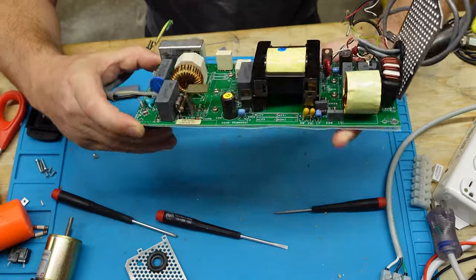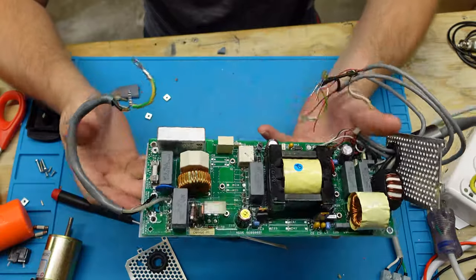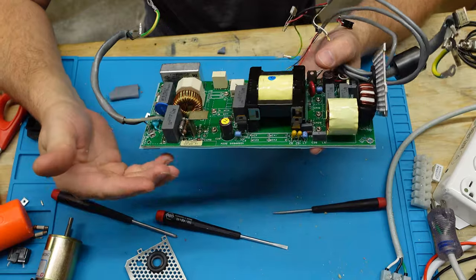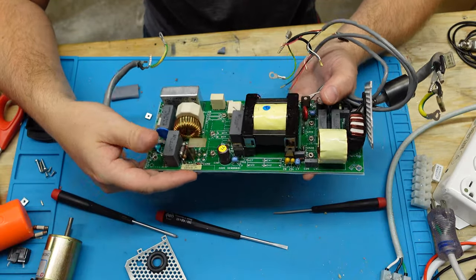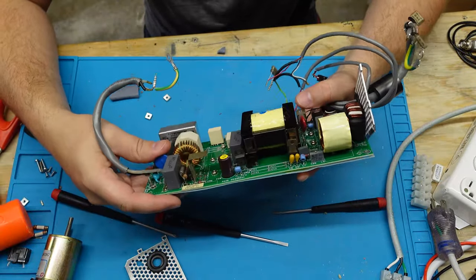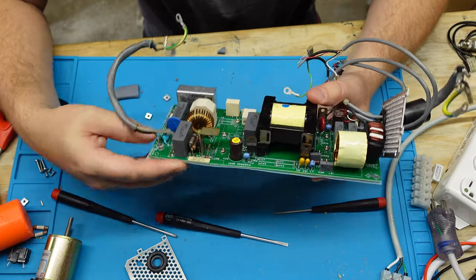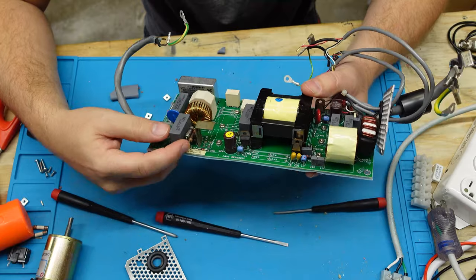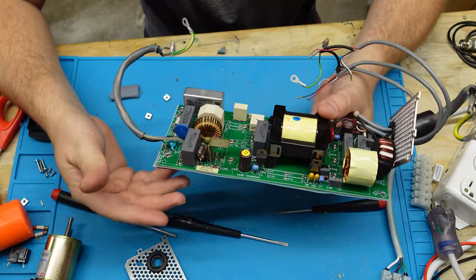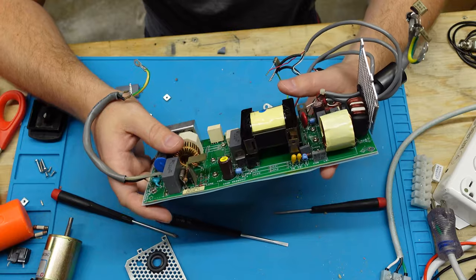So anyway, guys, I hope this was entertaining or maybe even slightly informative, because we never know what we're going to get when we open one of these up. And sure enough, just when you guess it, $3 or $4 worth of components can ruin a $1,900 power supply. So this is one of those times when you're like, hey, why do biomeds need to solder? Well, because if you improve those skill sets, then changing out two resistors, which are actually pretty easy to get to, can save you a lot of money, at least to make this a backup board, just in case.